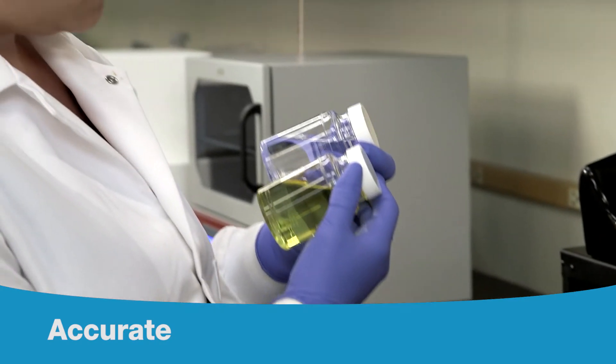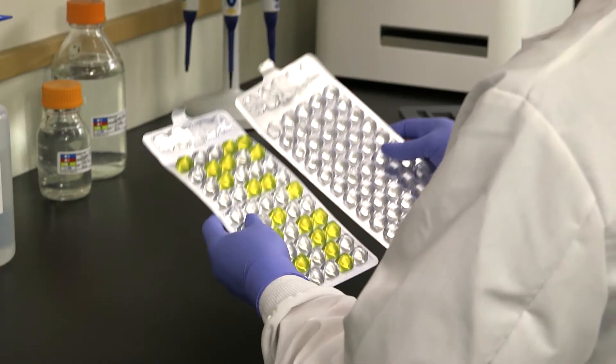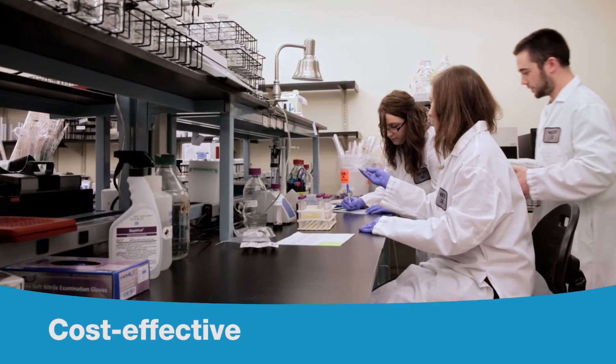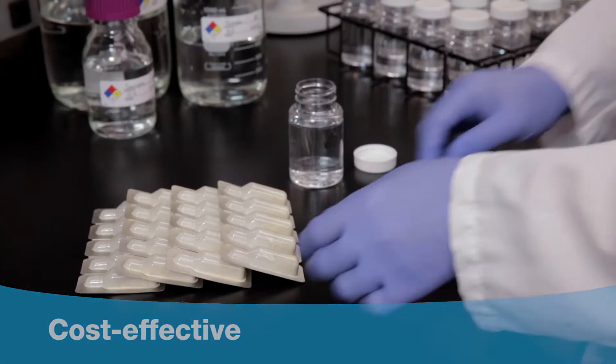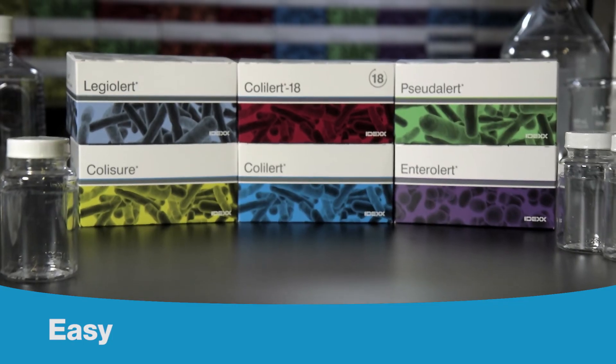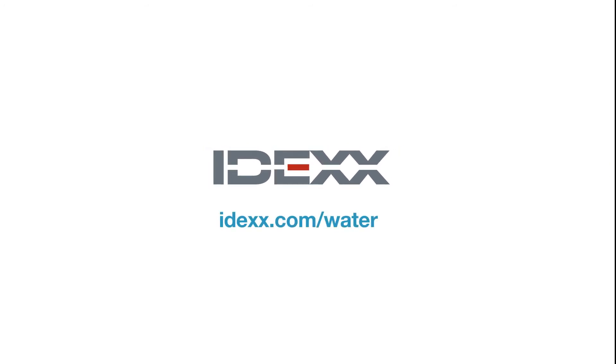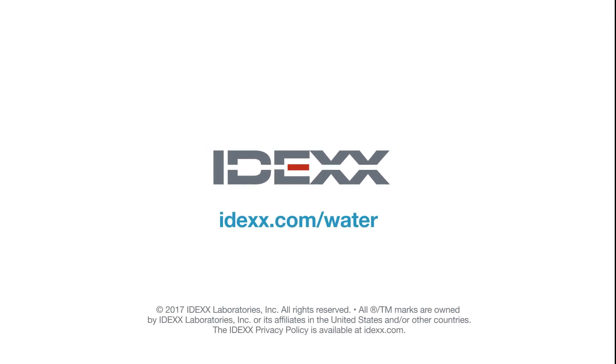Our breakthrough technologies deliver clear visual color changes that make detection easy and accurate. Our tests dramatically simplify workflow, saving time and increasing productivity. Easy. Rapid. Accurate. IDEXX. Visit IDEXX.com/water for more information.